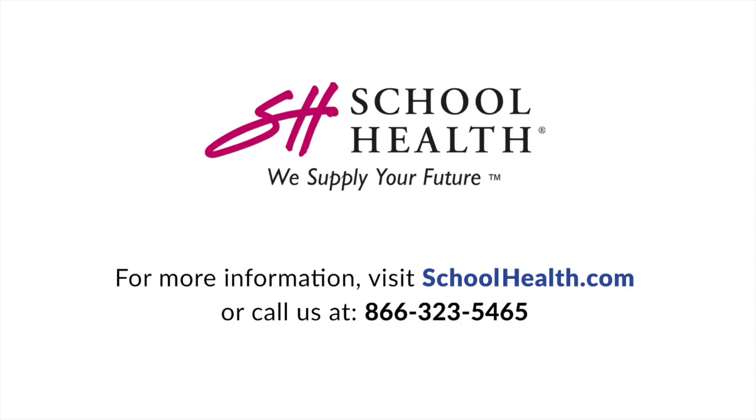This completes the tutorial on 3 ways to utilize the audiometry protocols within your screening process. Please continue through the tutorial series for additional easyTone instruction.